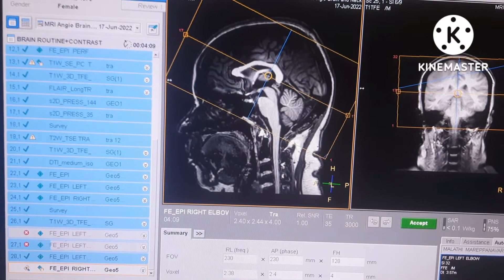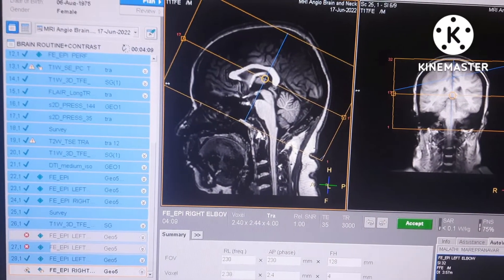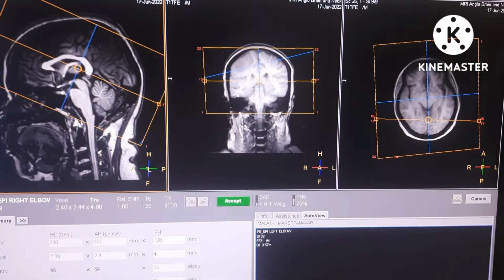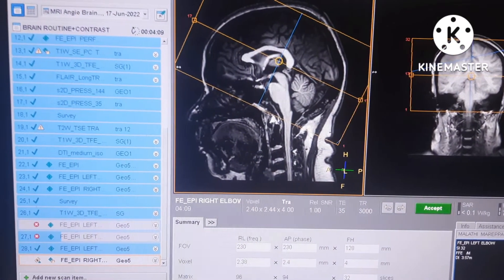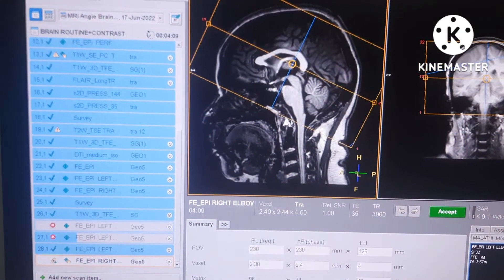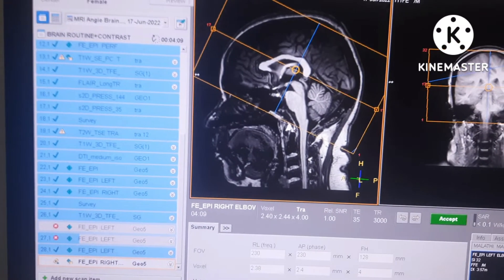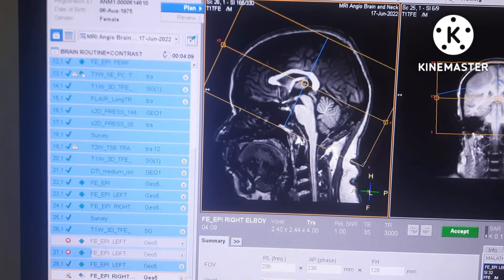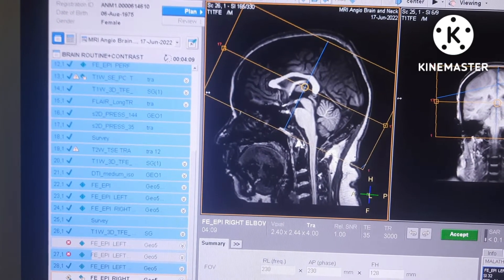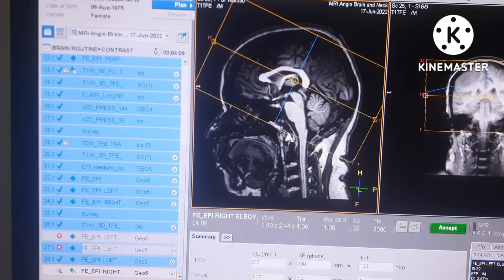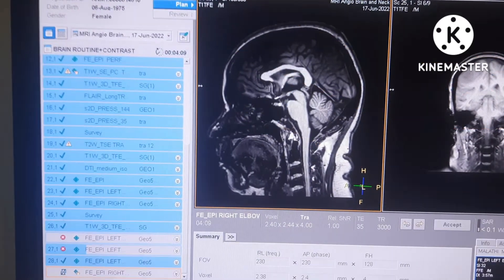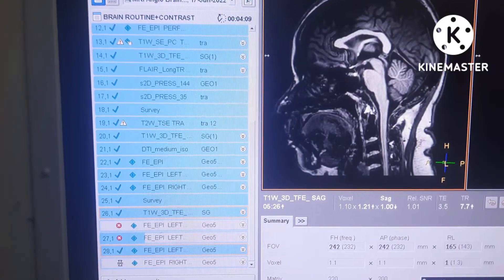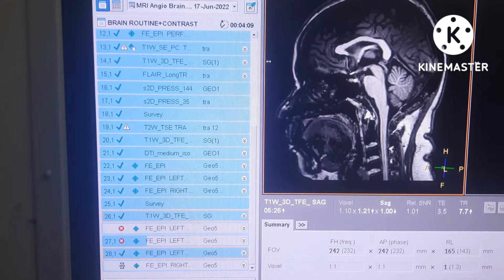Now we are taking for the right elbow. You can see the planning here on 3D sagittal and coronal as well as on axial — this is for the right elbow. We have completed the left elbow. According to the radiologist, we have to do the scan. Planning is completed and now we will start the scan for the rest and movement sequence for the right elbow.